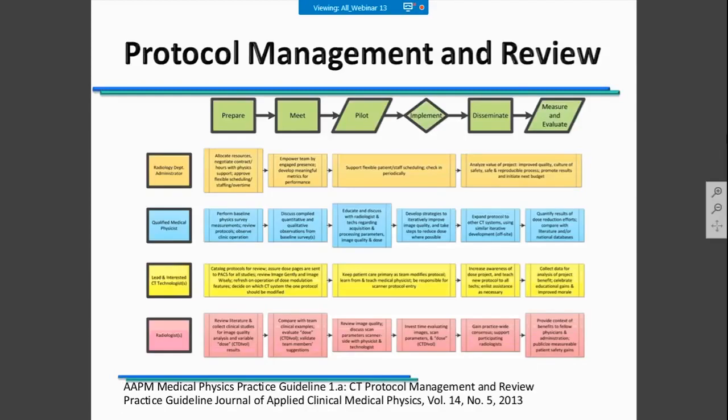Of course, if you compare your subjective image analysis and your objective image analysis together, you could have a comparison about what is happening in your image in terms of quality, considering that you have changed the protocol.